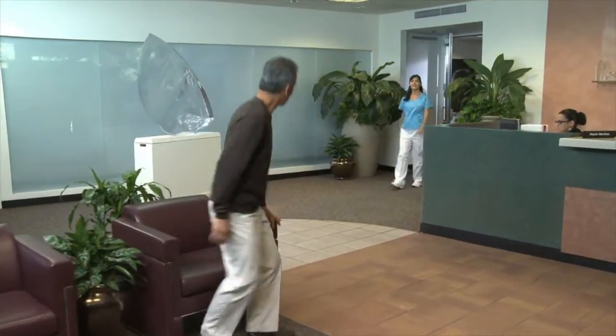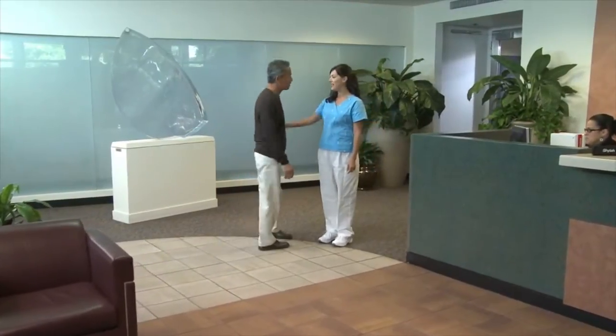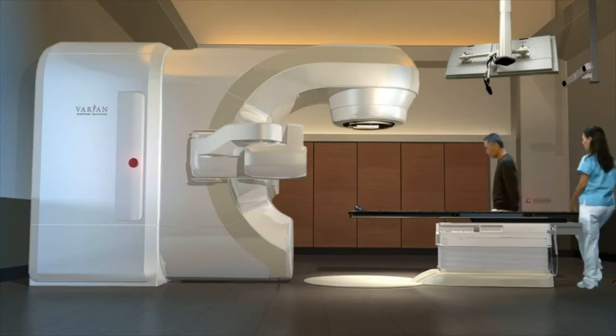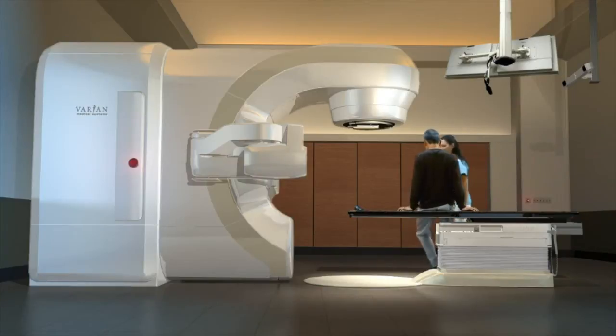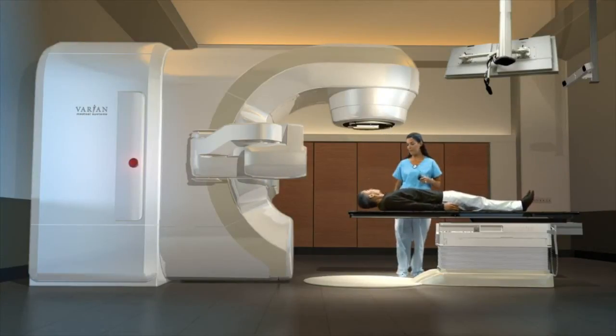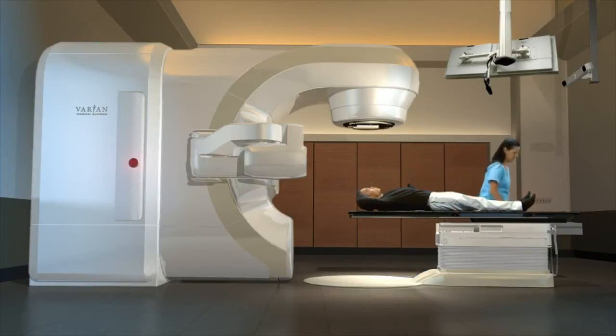Your actual treatments will be administered by a radiotherapist, or RT, who will also guide you through the process. You'll want to wear comfortable clothing, or you may be asked to change into a hospital gown. The treatment takes place in a specially designed room where the radiotherapist will help you lie down on the couch. A marker block is placed on your chest. This allows the software to track your breathing.